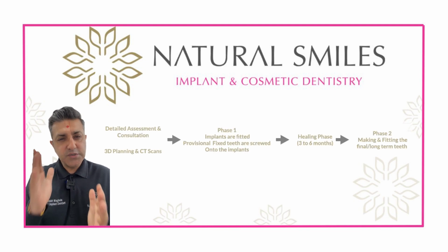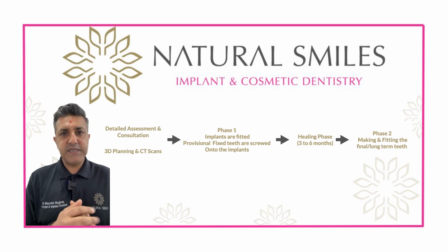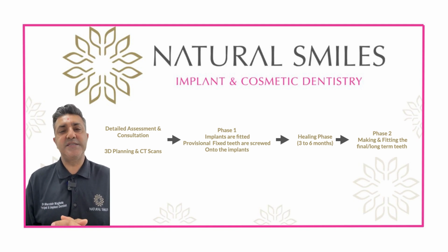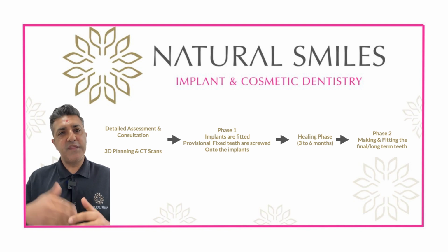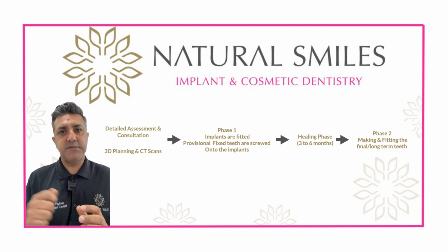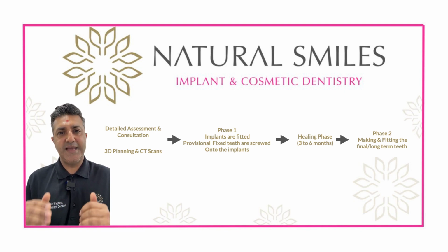Usually this is a two-stage procedure. So stage one is where we remove the teeth. We usually fit the dental implants on the same day as taking the teeth out. And what we're then doing is allowing things to heal, and we're giving you some teeth on the same day, on that first day. So take the teeth out, put the implants in, allow our technician and myself to make a set of temporary teeth that are screwed in on that day.